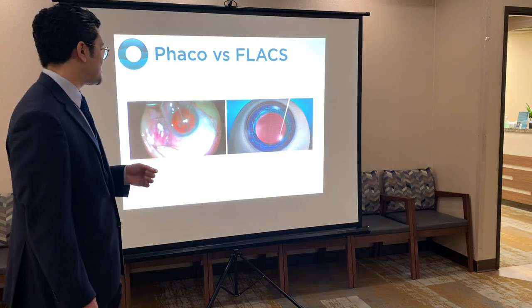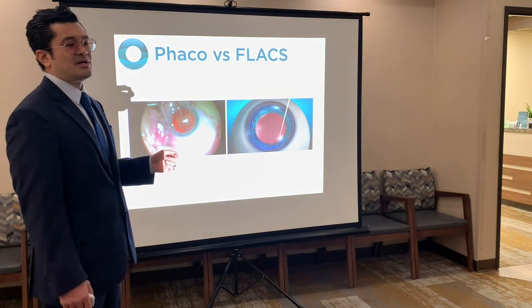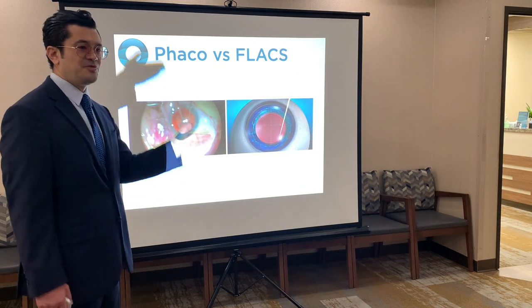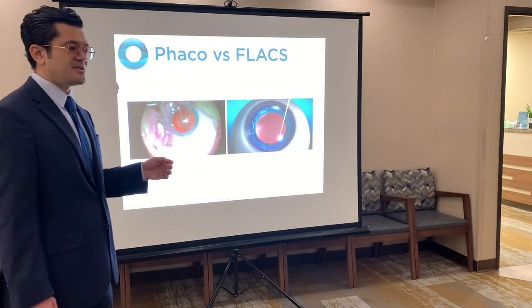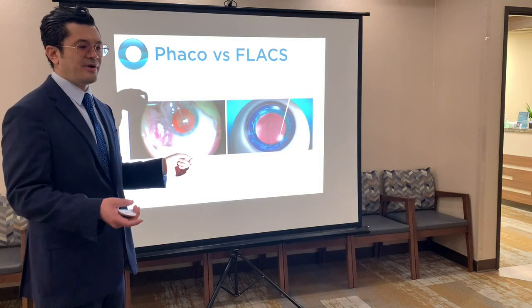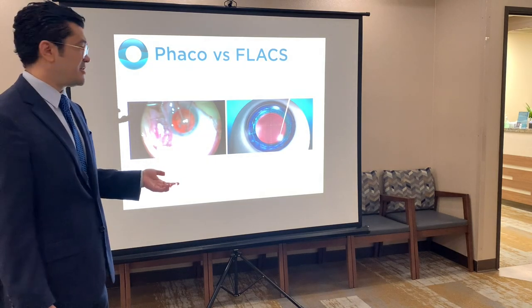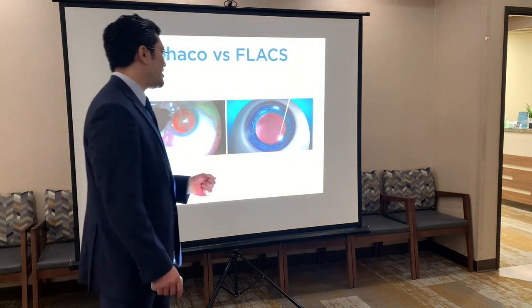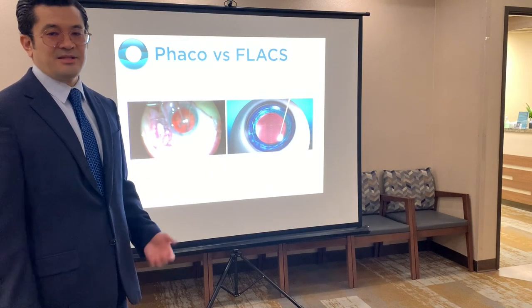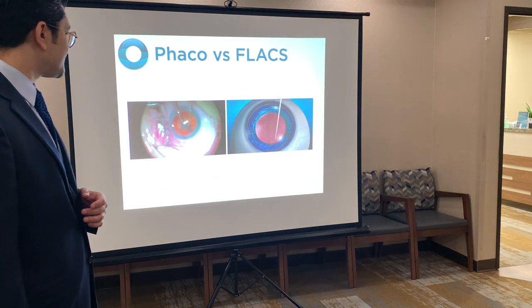Well, two methods. One is on the left-hand side, you're going to see what's called the CHOP method, where instead of grooving and trenching through the center, we use both of our hands to chop up the cataract into wedges. That way there's less ultrasound energy. Or the other method is on the right, you'll see that's using the laser. So let's play those side by side so you can see the comparison.